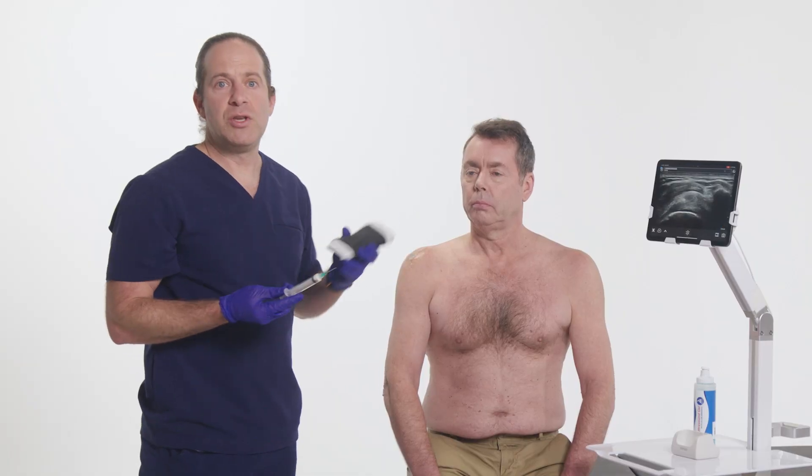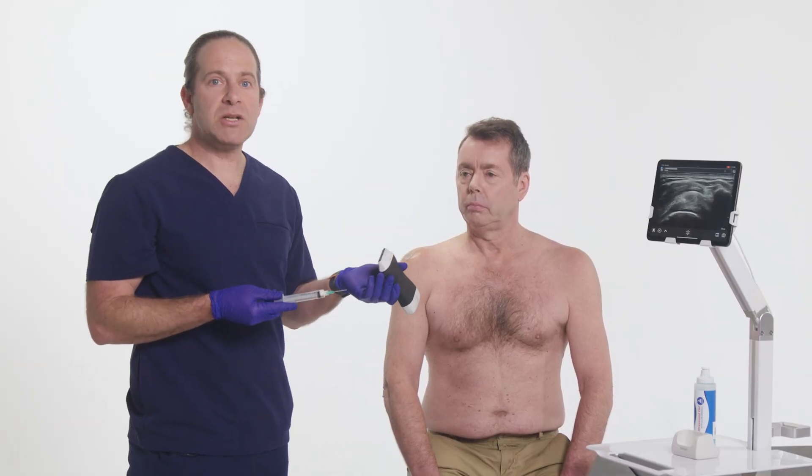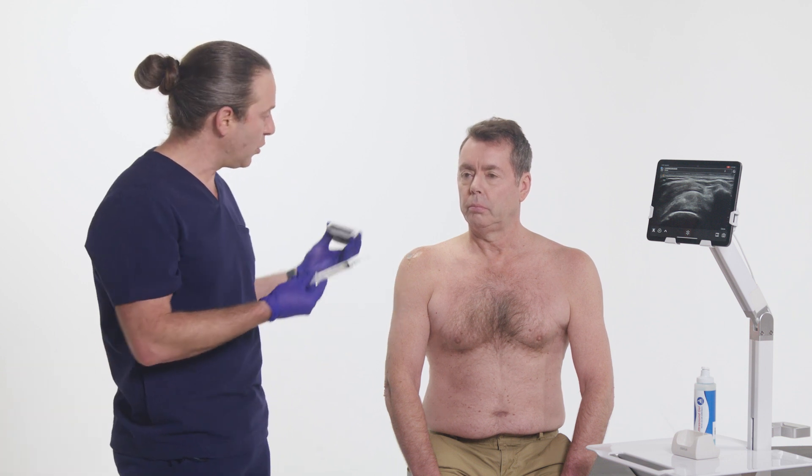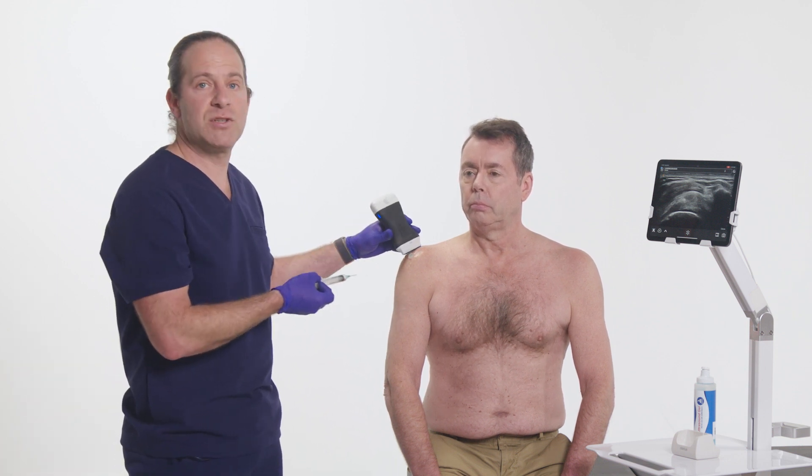With Voice Control, you can see that I don't ever need an assistant or to put down my scanner during the entirety of the procedure, allowing me to focus on my patient and doing the best and safest job possible.